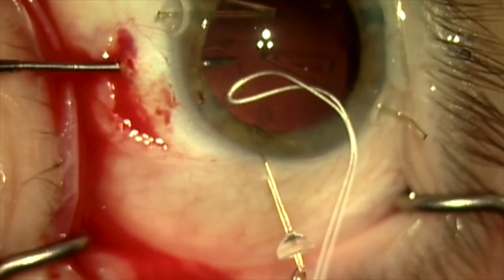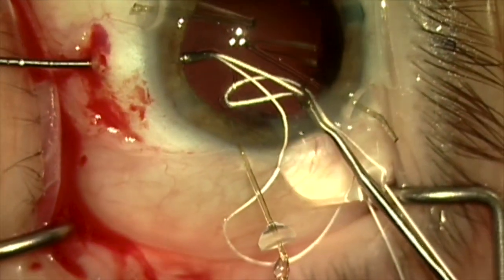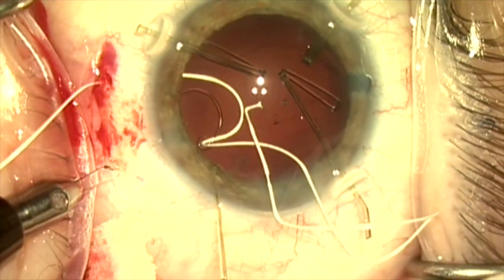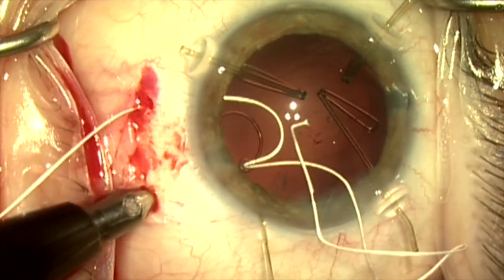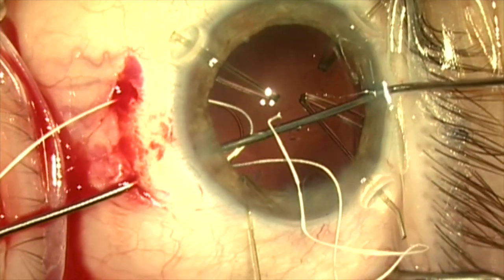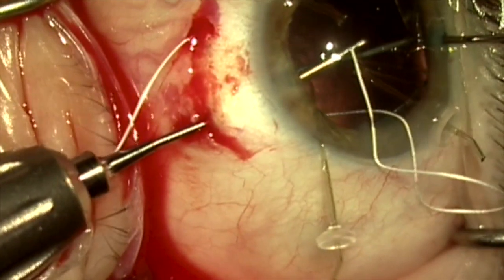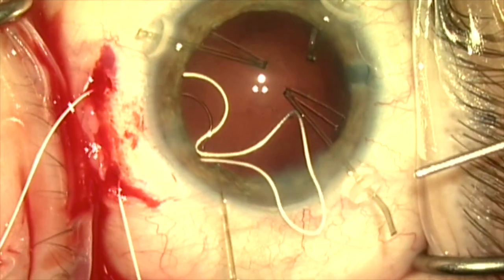I'm now going to hand the Gore-Tex suture to my other hand so I can pull it out through the sclerotomy. We're going to make a second sclerotomy, also 2 mm posterior to the limbus. Again, there was a tight space between the back of the iris and the anterior capsule, so I'll provide some space by pushing down with my right hand, injecting dispersive viscoelastic, and then grabbing the Gore-Tex suture to pull that other end out.